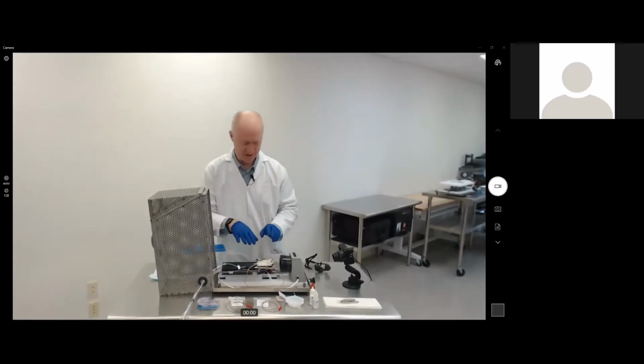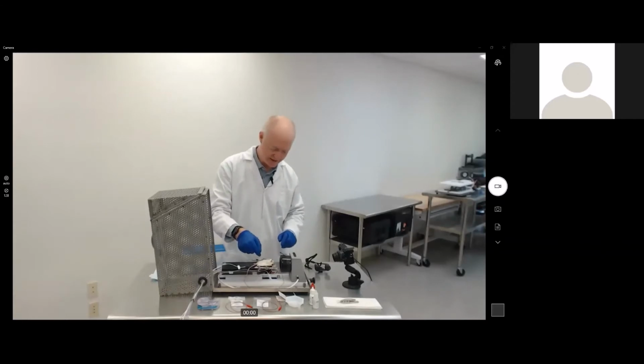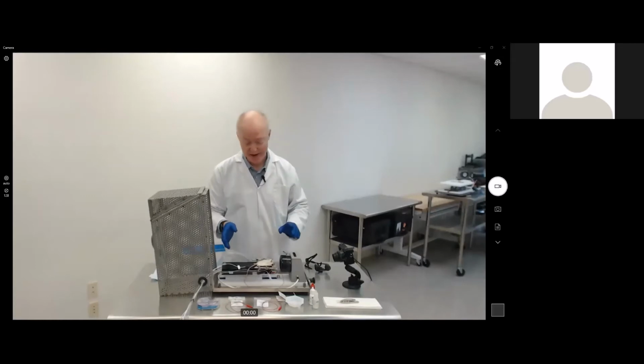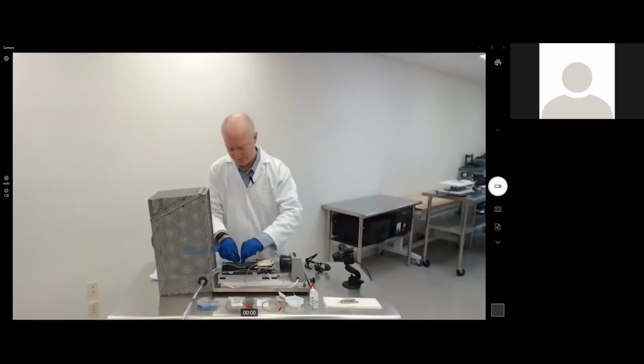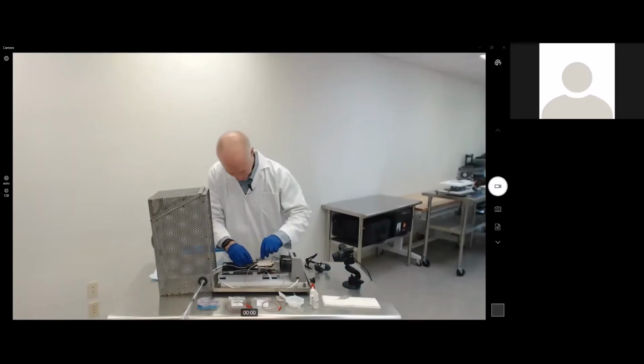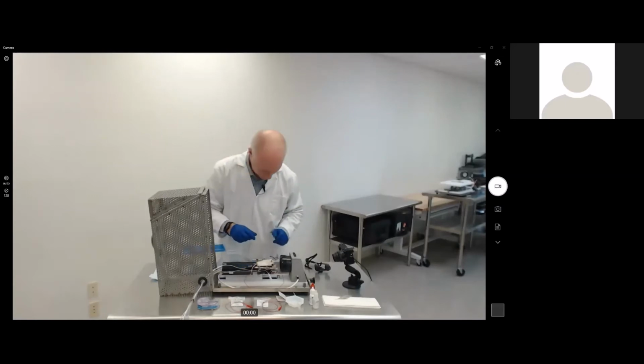Okay, so now I've placed the probe into the animal, as well as I have the mouse into the face masks. So I'm basically going to go through a process of putting in first the ground, using my forceps into the back of the tail, just into the skin, right at the surface. Then I'm going to insert my references.